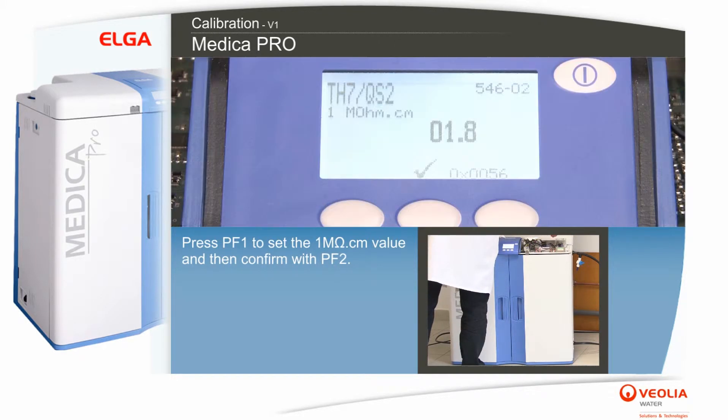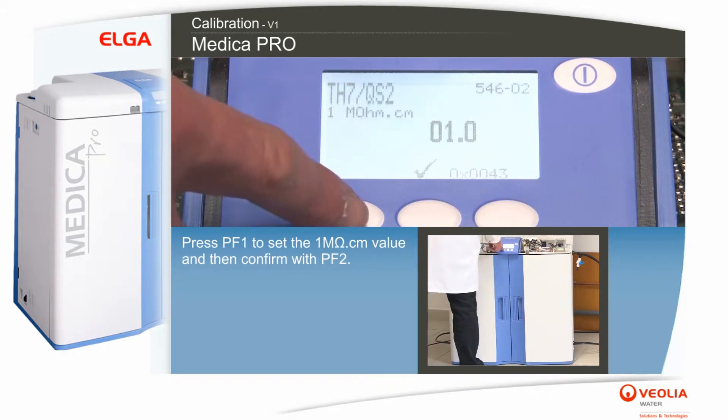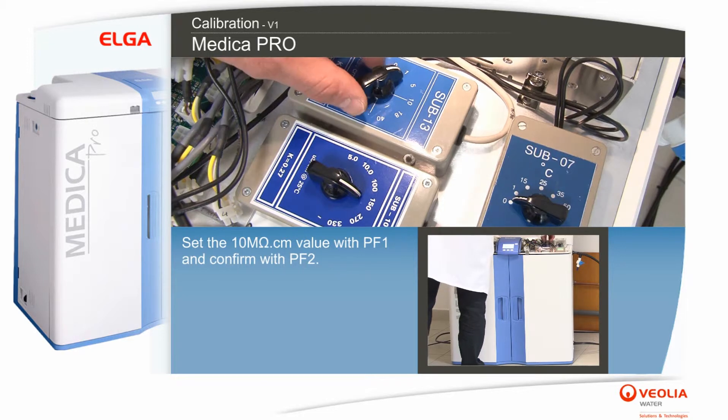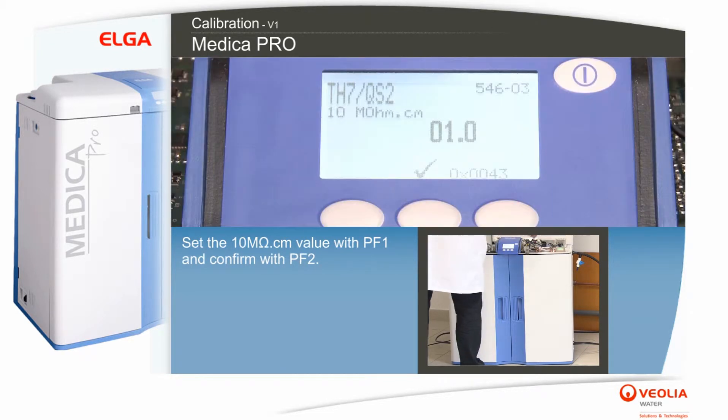Press PF1 to set the 1 megaohm centimeter value and confirm with PF2. Set the 10 megaohm centimeter value with PF1 and confirm with PF2.